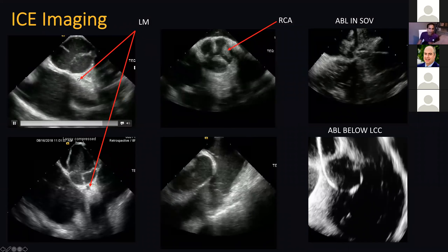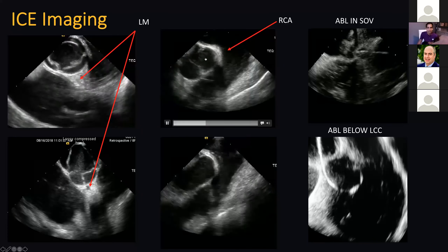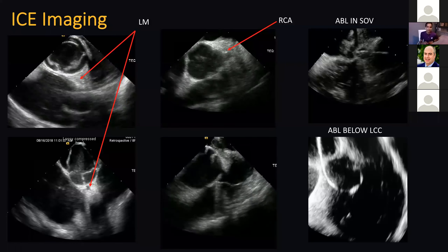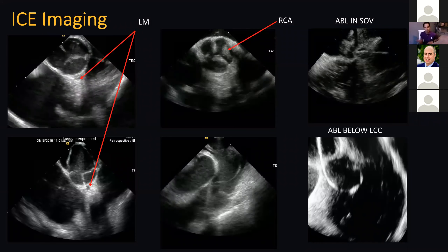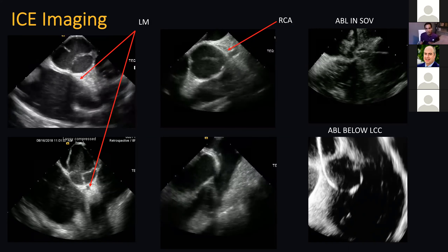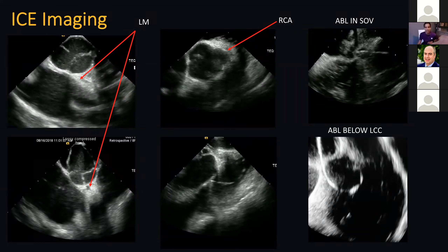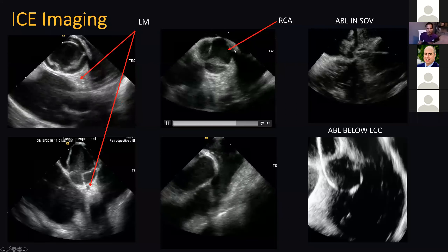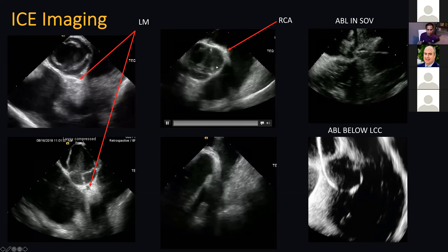The left main is very easy to image. The right coronary artery can be a little bit tricky — it's at the 1 to 2 o'clock position. One way I find structures when I'm having trouble imaging the coronaries is to do the electroanatomical fan map first, and then with the fan map you can actually point to specific structures and start looking with more precision.